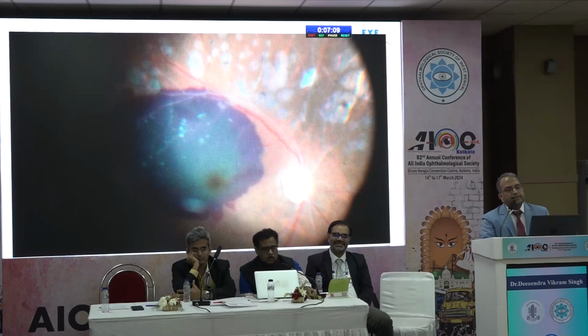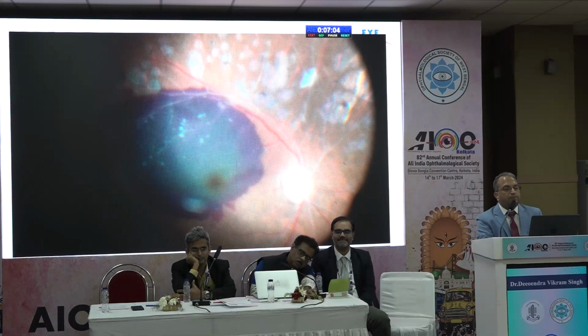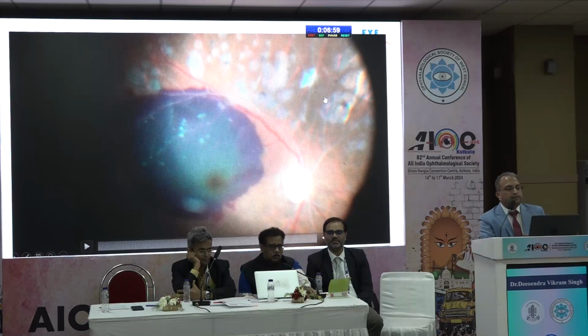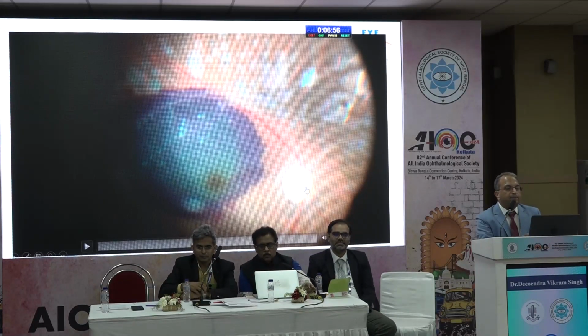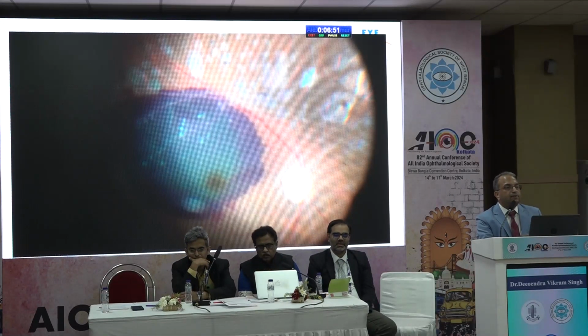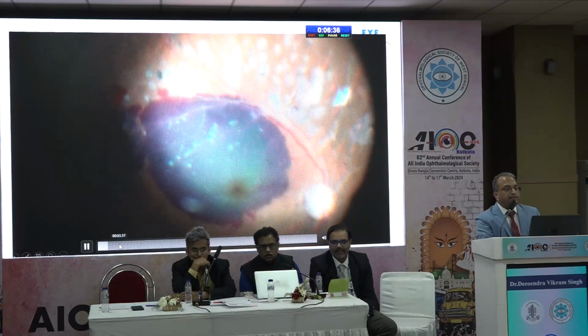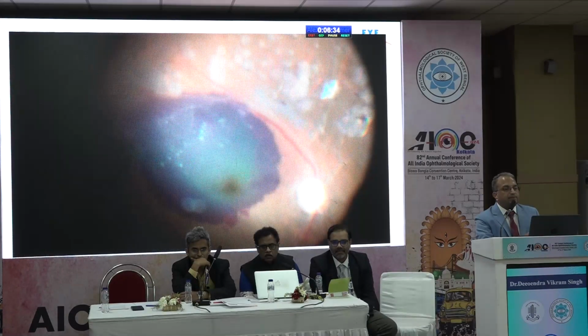So this was one case, and then this is another case, again a patient with proliferative diabetic retinopathy, where we had done VR and removed silicone oil. He was doing well with 6/12, 6/9 vision, despite having a very pale disc. And then this guy deteriorated. He was on dialysis, and he developed sudden loss of vision and this submacular hemorrhage. Now I knew that this guy was in a wheelchair, and he was not going to maintain any kind of position. Prone positioning was almost impossible. So again, we just decided we'll inject subretinal TPA and maybe some air and leave him alone.